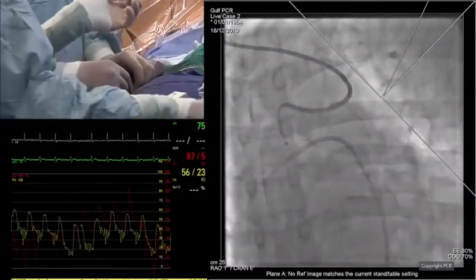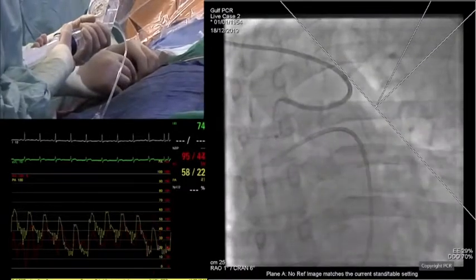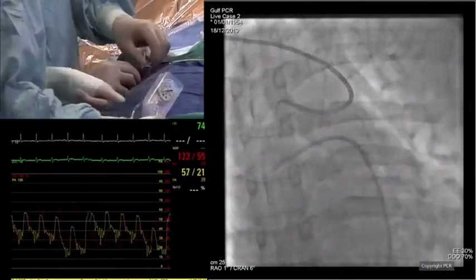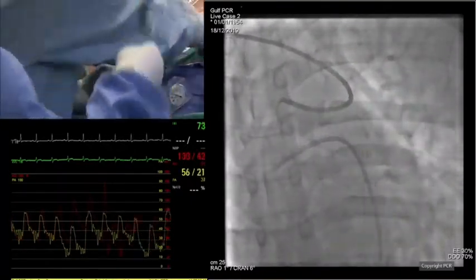I'm just going to show you how I'm going to save this, hopefully, because everything came out. Let's see. Okay, now it's here. Let me take the guide liner if I could. So I have the guide liner in hand. You see that?